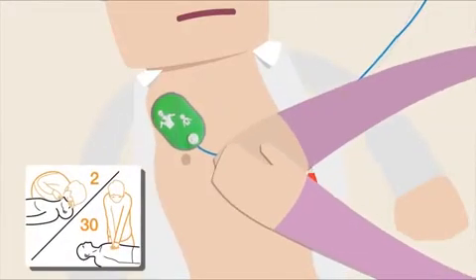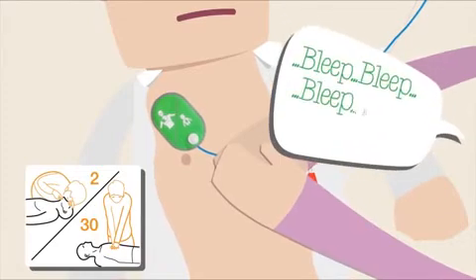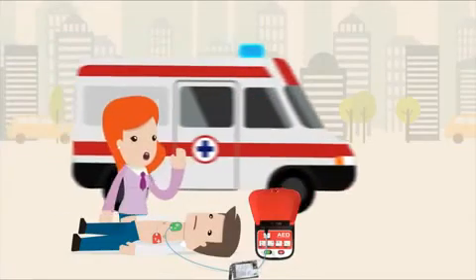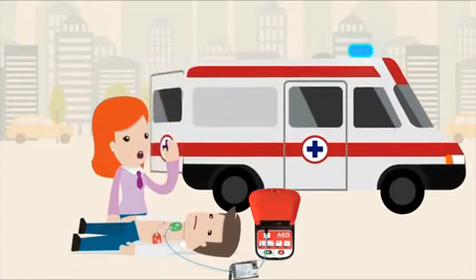After the shock, leave the pads attached and immediately resume giving CPR. The unit will sound a metronome for you to keep rhythm. Stay with the patient until the paramedics arrive, as there is always the chance they may have another cardiac arrest.